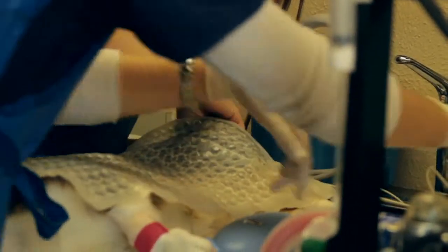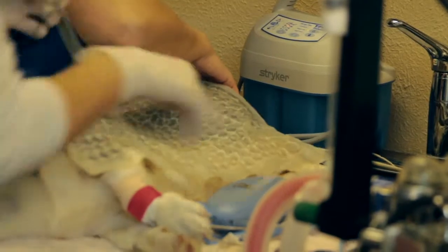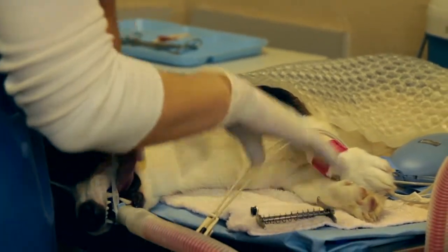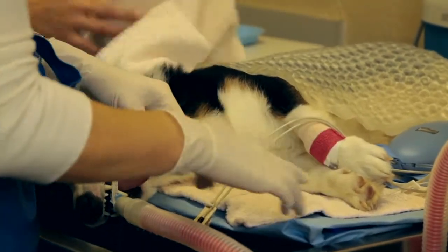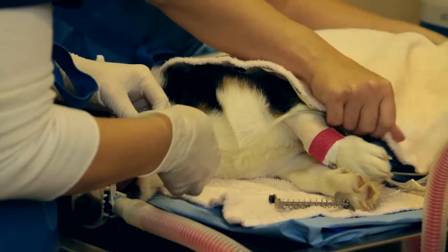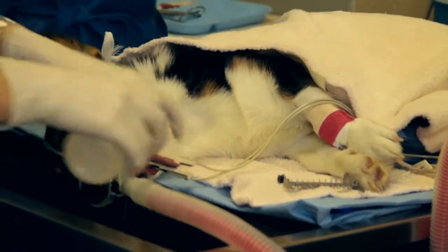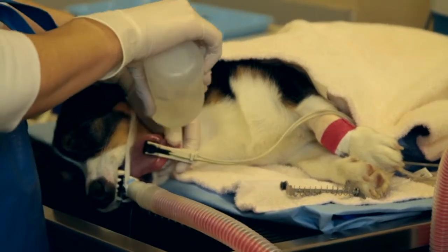SNAP is lying on a device called a chill buster that is a heating pad. Then on top of SNAP, we have a warm water circulating heating pad. And so we really worry about these little critters getting cold, so we constantly monitor their body temperature. That makes anesthesia so much safer.